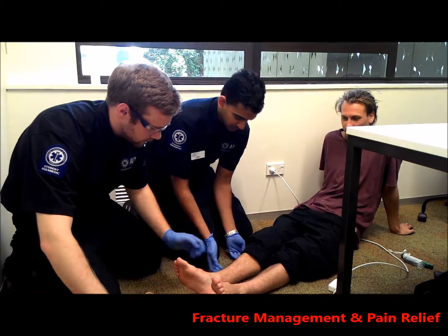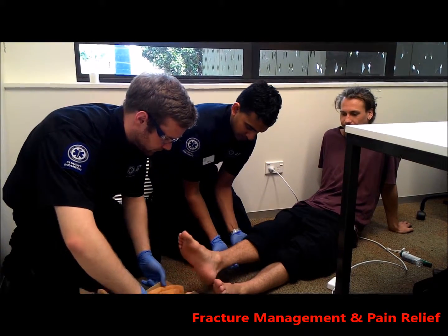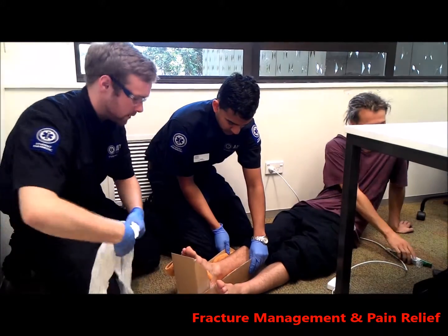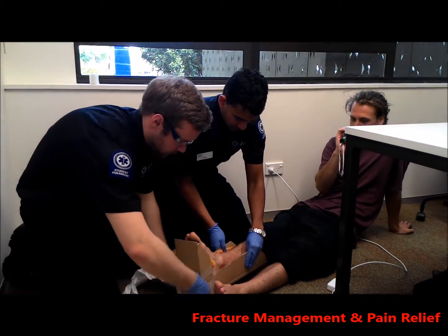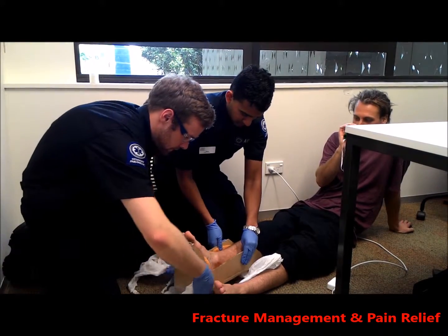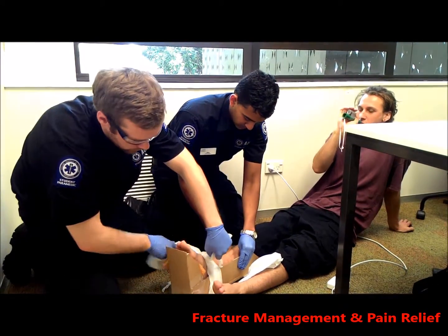So Sam, we're just going to lift up your leg and I'm going to slide this underneath. Okay. Making sure you're breathing in and out through your inhaler. Take the pen away, and we're going to have Dave lift that up. Dave, slide that here. I'll slide the next one. Yeah. So securing above and below the fracture.